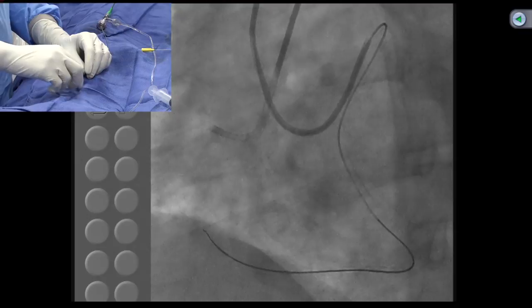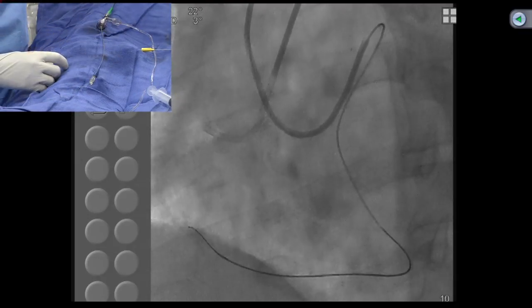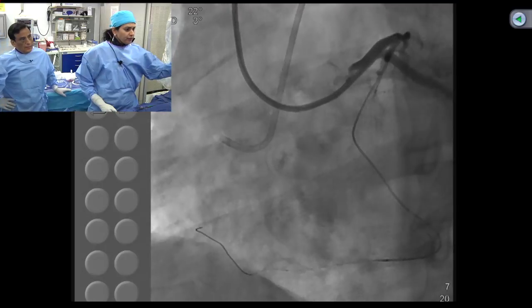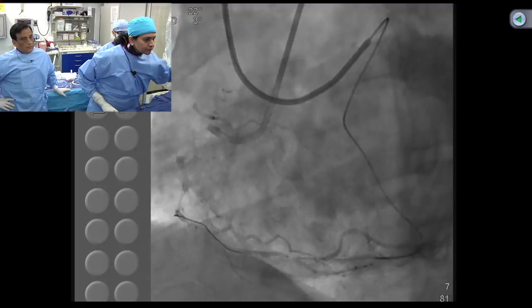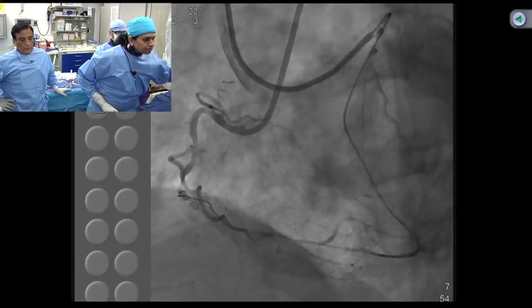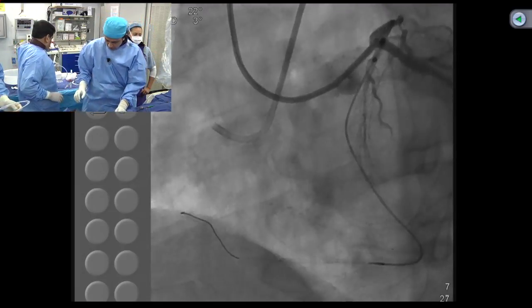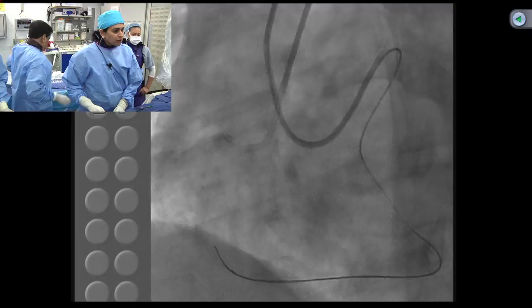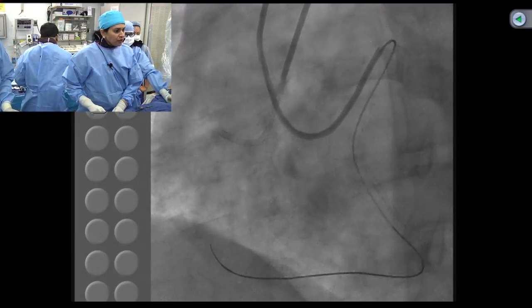Confianza 9. What has happened? The question is what has... Why don't you try the Integrate right now? Get one wire, one small balloon, Integrate. Or just let me do one wire exchange here. So Confianza is your next choice? No, we try Miracle 6.